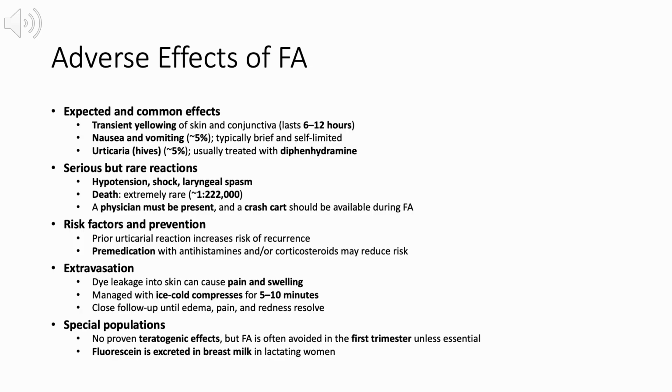Certain factors increase the risk of adverse reactions. A prior urticarial reaction raises the likelihood of recurrence, and premedication with antihistamines and/or corticosteroids may reduce risk in selected patients. Extravasation of fluorescein into the skin can cause pain and swelling, and is managed with ice-cold compresses for 5 to 10 minutes, with close follow-up until symptoms resolve.